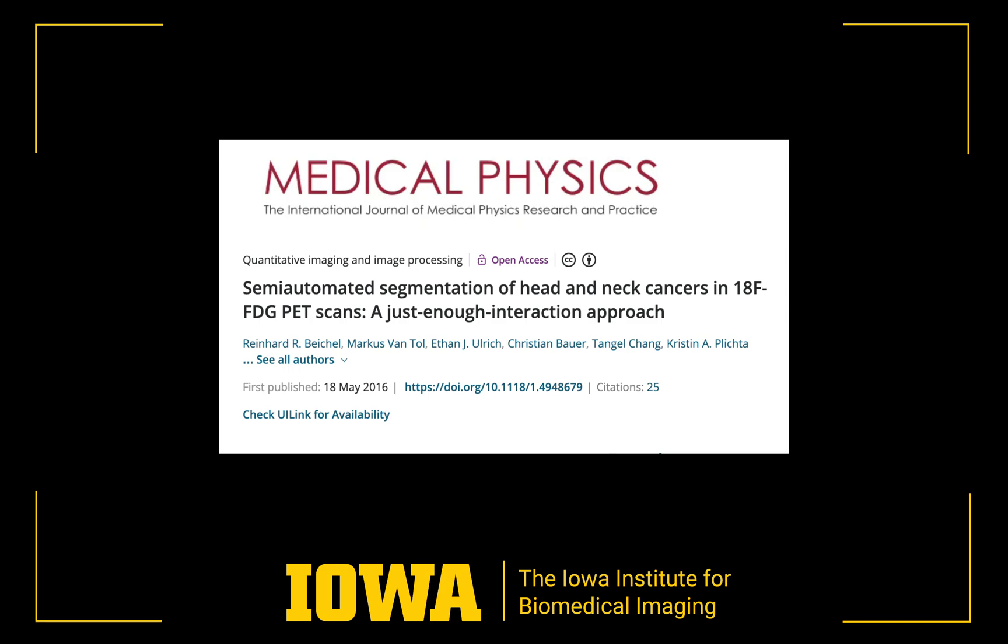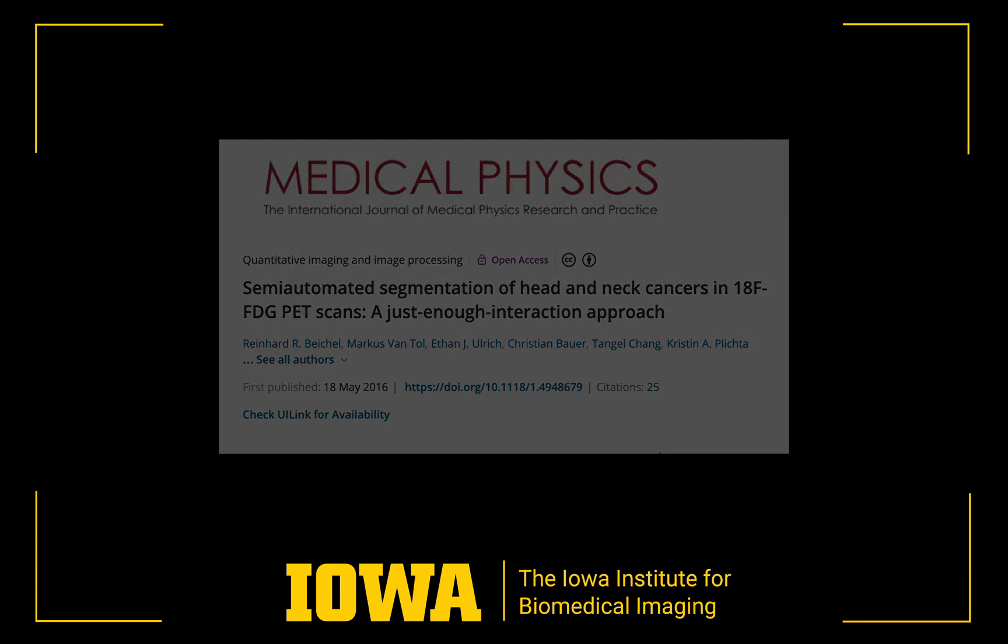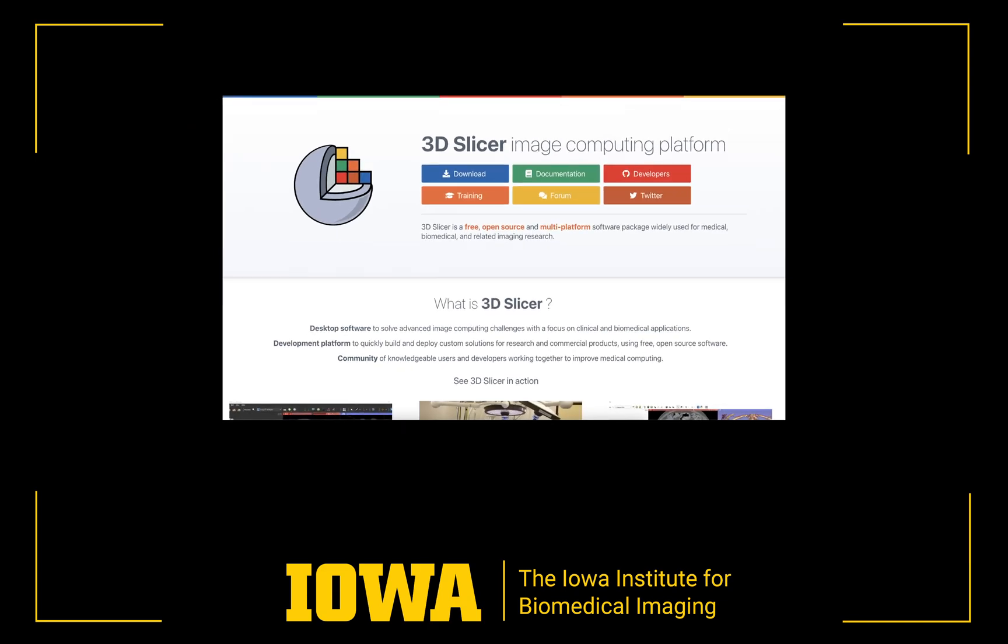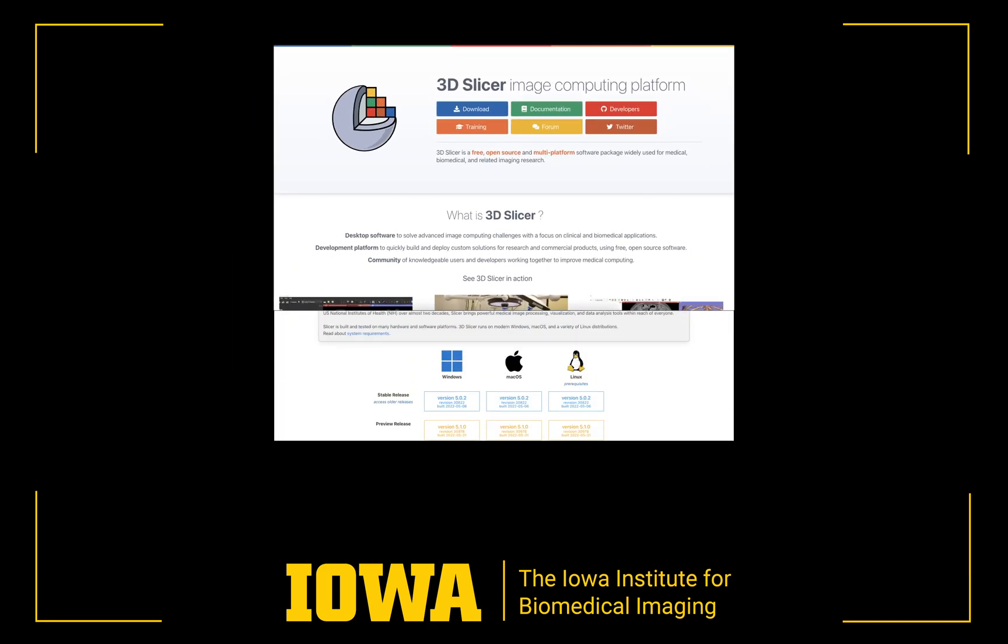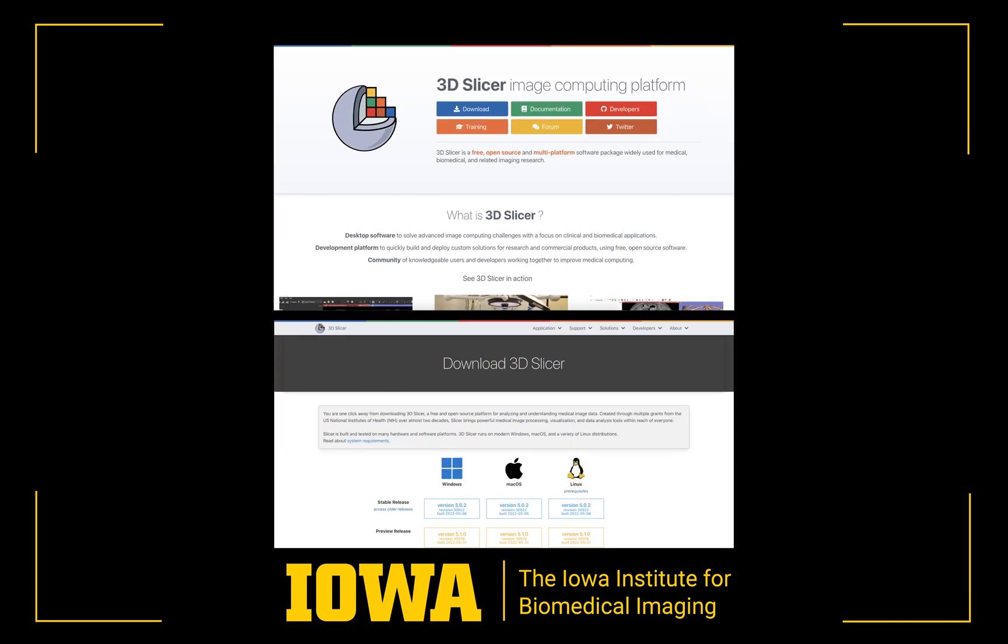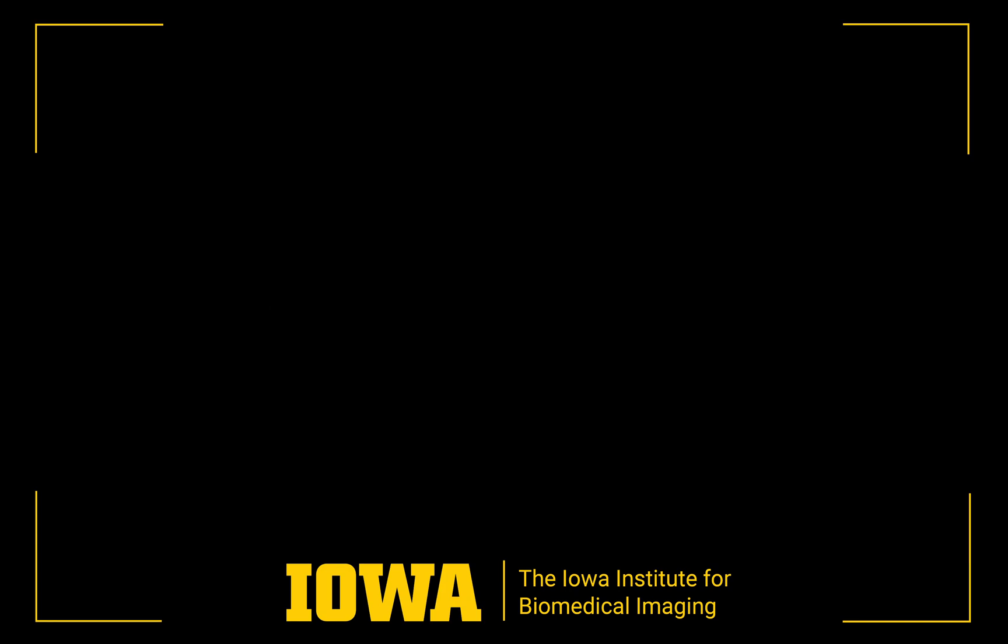This video will cover installation and usage. In this example, we are using 3D Slicer version 5.0.2. Note that the tool is available for several versions of 3D Slicer. Please use Slicer's Extension Manager to check availability for the version you are using.